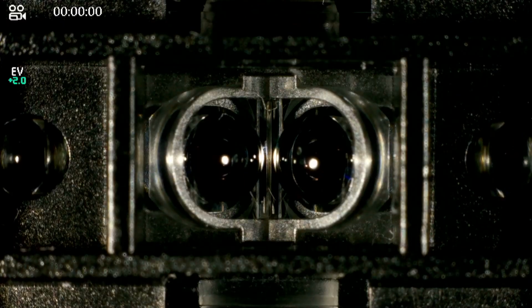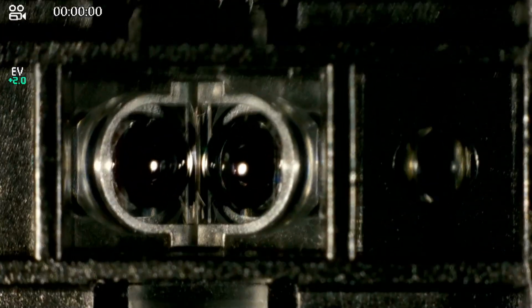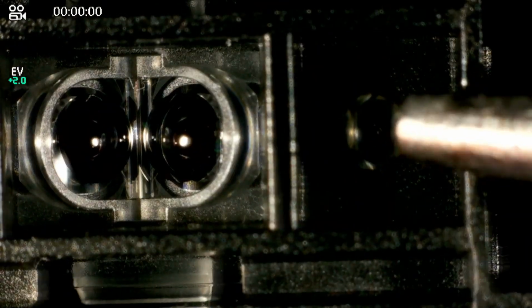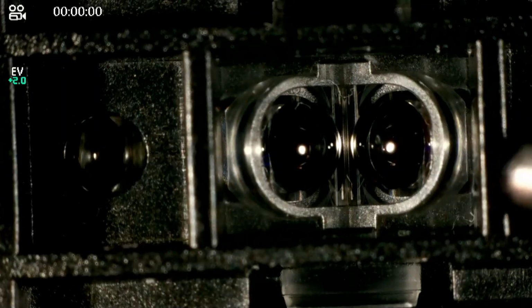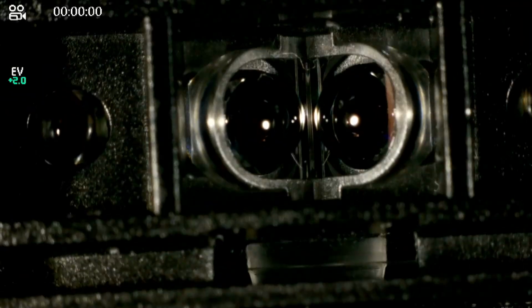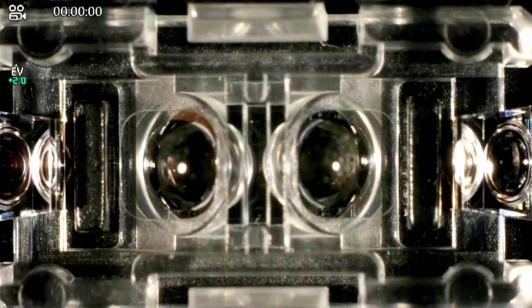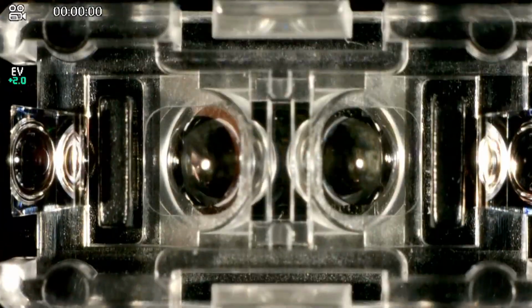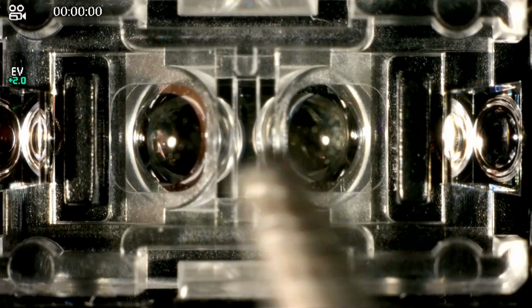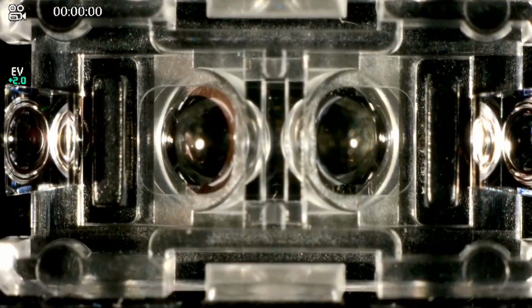So here's the optics from the side of the LEDs. So this is where the LEDs shine into. I think there's two bigger white LEDs that you saw shine over here, and these two lenses focus the result back onto the detector. Now everything is here at an angle. So if I look at the other side, this is the side that faces the actual strip. You can see the nature of the angled parts there in order to make sure that everything is kind of focused on the right spot. And as the dye, for example, would move forward, I think you can read whether it has progressed or not. Again, that's just my guess, but that kind of makes sense.